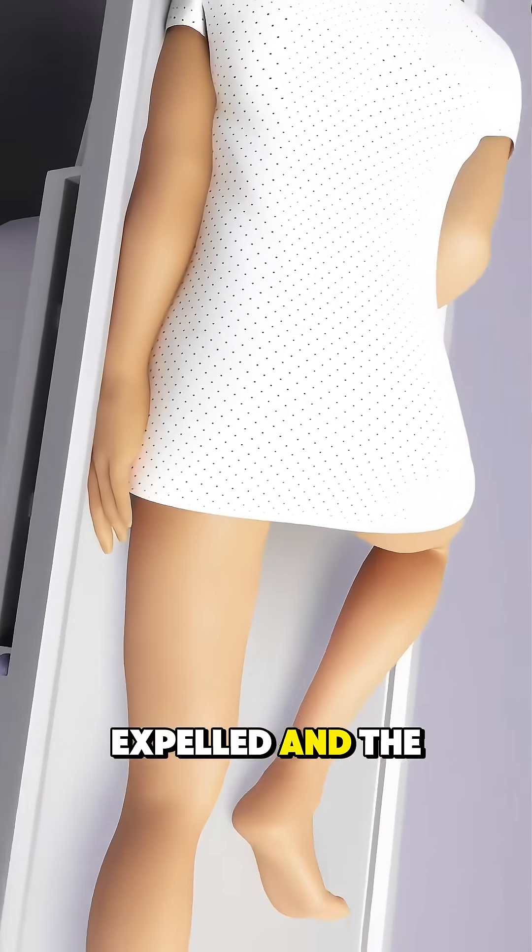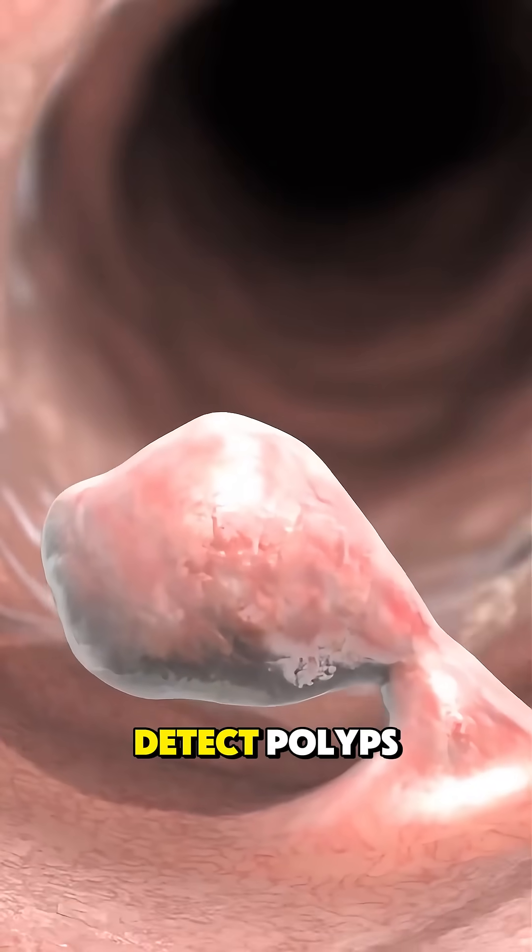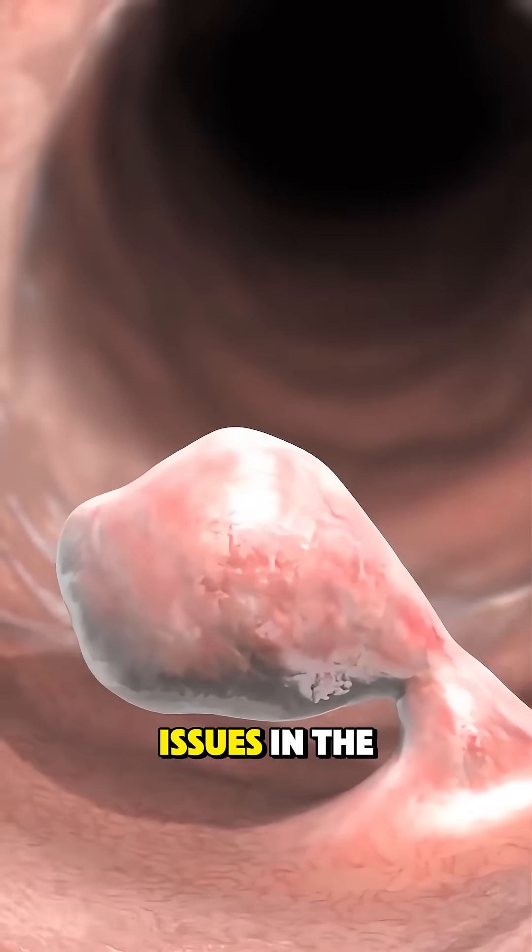Once the test is complete, the barium is expelled, and the patient may be advised to drink plenty of water to flush it out. This procedure helps detect polyps, tumors, or other issues in the colon.